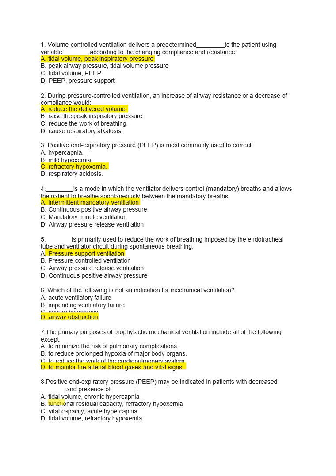In intermittent mandatory ventilation, there will be ventilator driven breaths or mandatory breaths, and in between, if the patient is spontaneously triggering a breath and adequate tidal volume is reached, there will be intermittent patient triggered breaths also. So it has both ventilator triggered and patient triggered breaths.